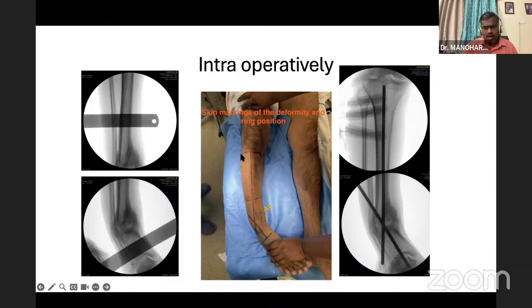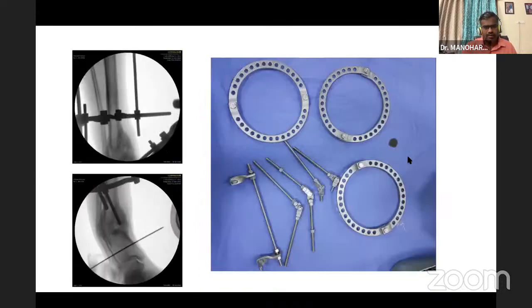These lines indicate the level of the rings, which I had pre-assembled before autoclaving. Then, using the Ilizarov rods, I marked the center of the axis, the anatomical axis of the proximal and distal fragments, and the CORA was found. I marked everything in the sketches.